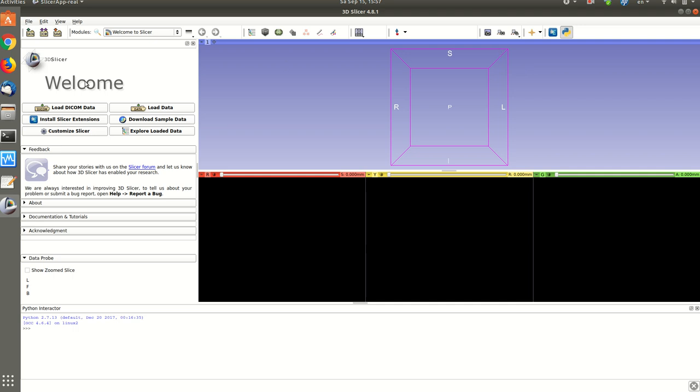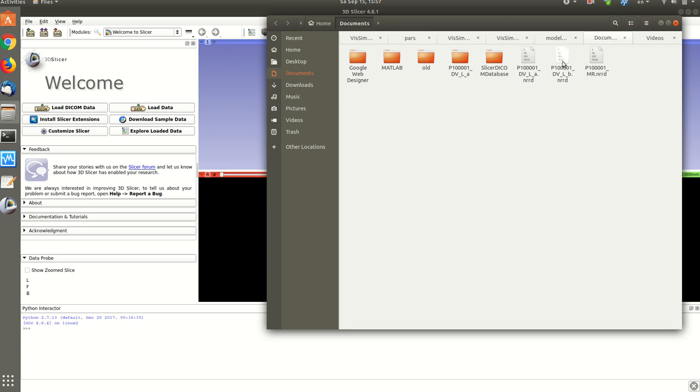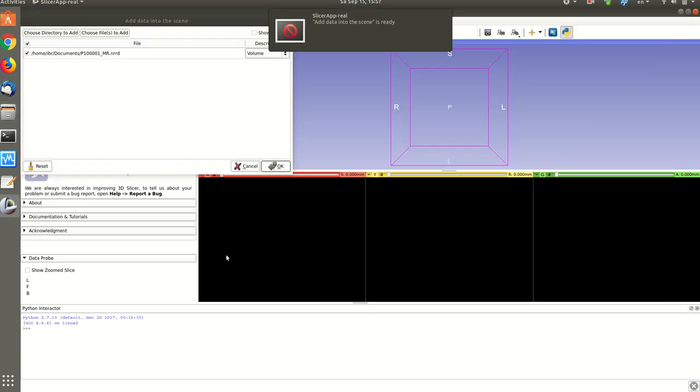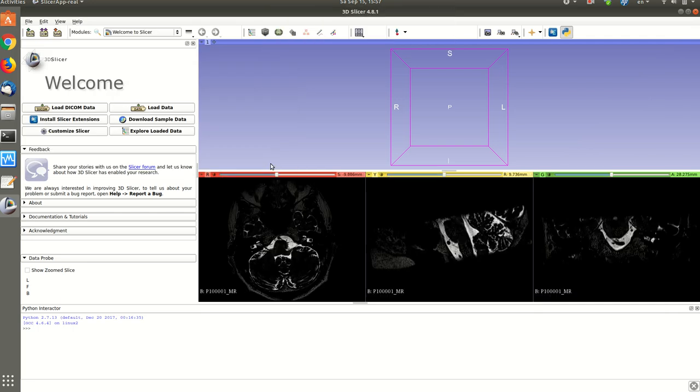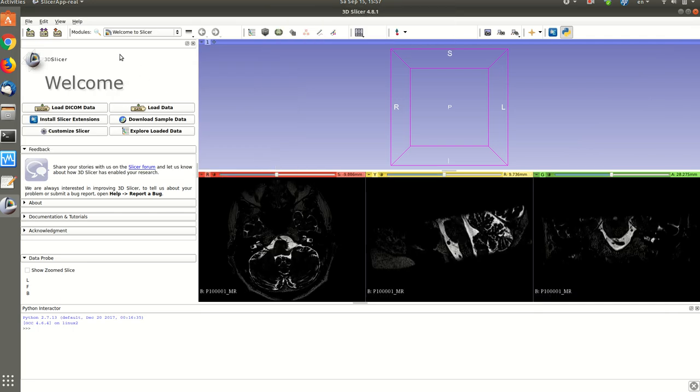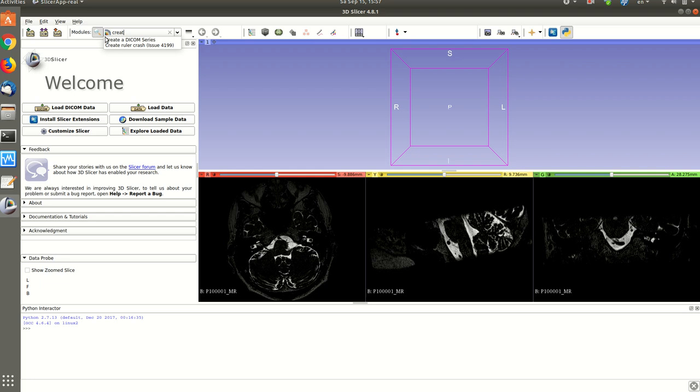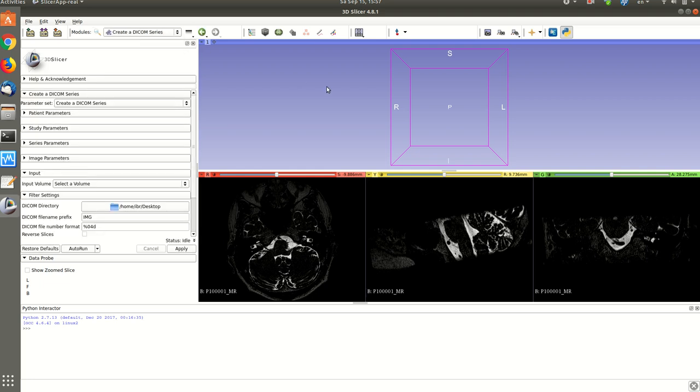It's very simple. If we have an NRRD image, let's say you have this one, you load it to slicer. Then in slicer there is already a module that creates a DICOM series from volume.